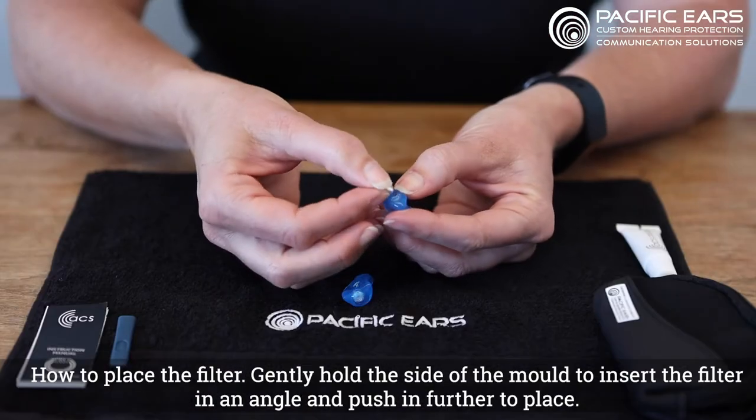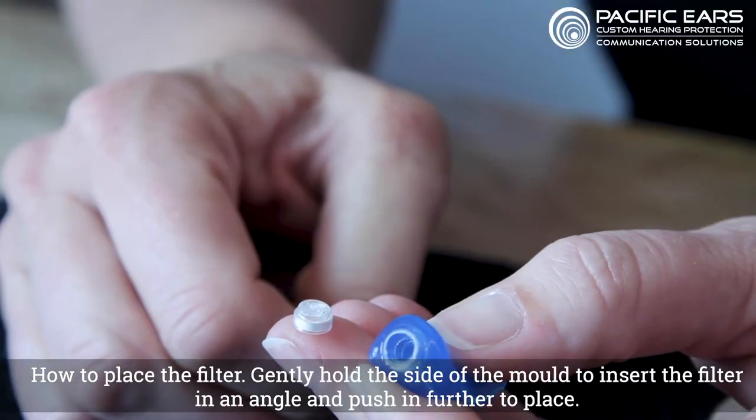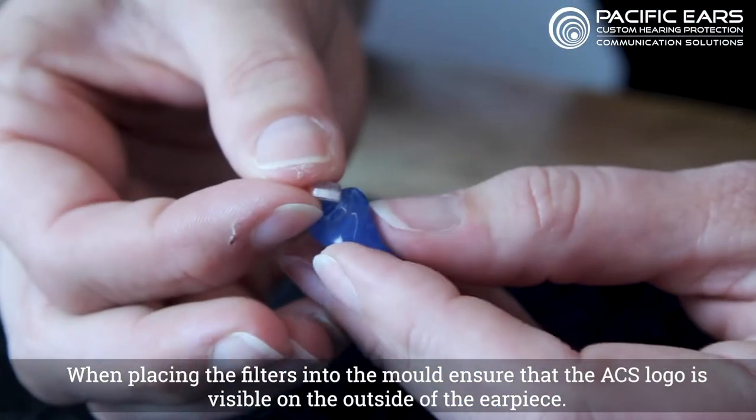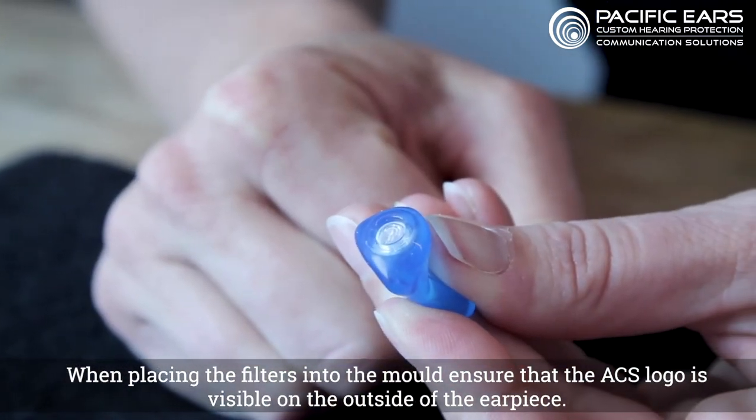How to place the filter: gently hold the side of the mold to insert the filter at an angle and push in further to place. When placing the filters into the mold, ensure that the ACS logo is visible on the outside of the earpiece.